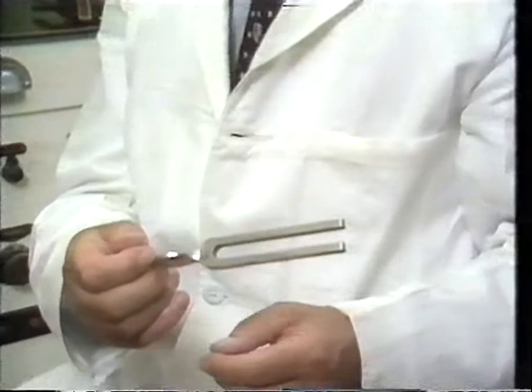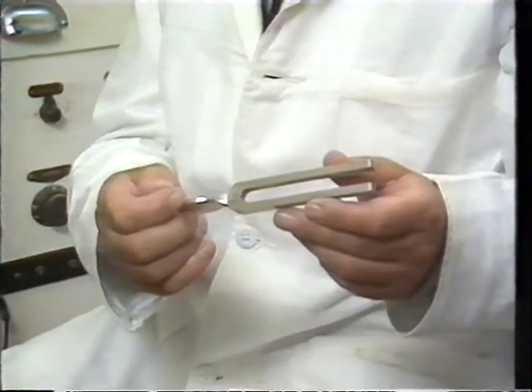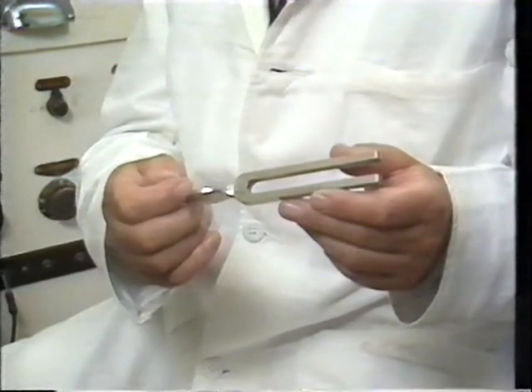Finally, of course, hearing must be assessed. Although this requires elaborate audiometric procedures, the correct use of tuning forks for the Rinne and the Weber test still provide the most reliable way of distinguishing between a conductive and a sensorineural hearing loss. It is important to use a fork of 512 Hertz. Higher frequencies decay too rapidly, while low frequencies stimulate vibration sense.